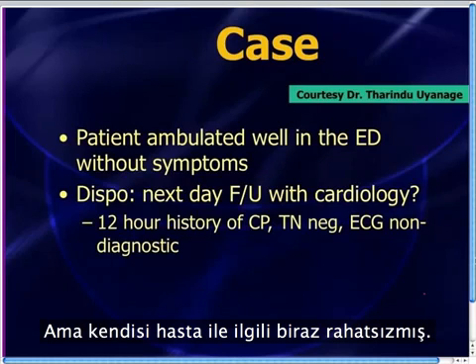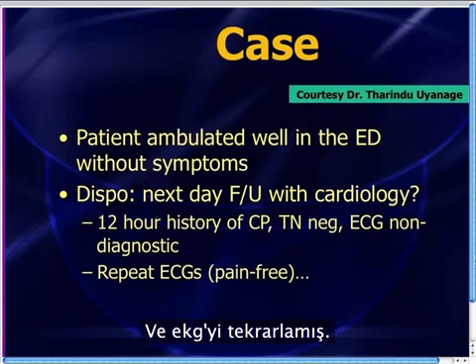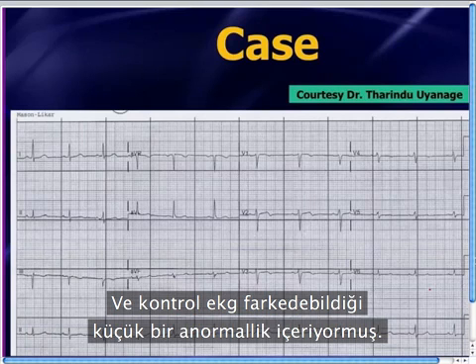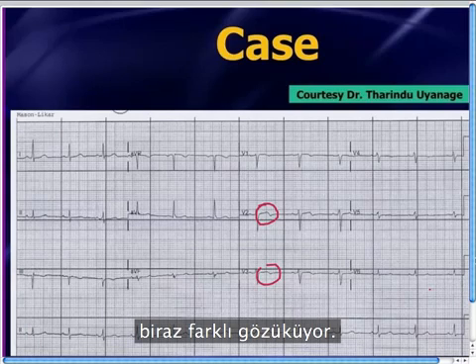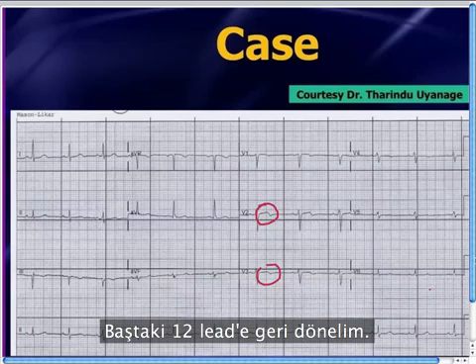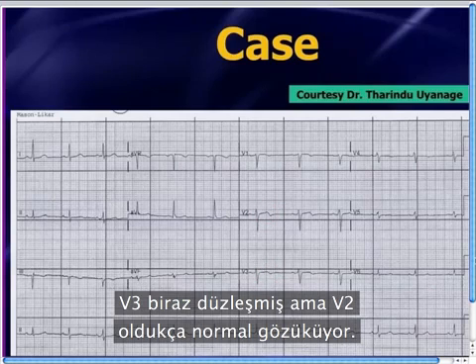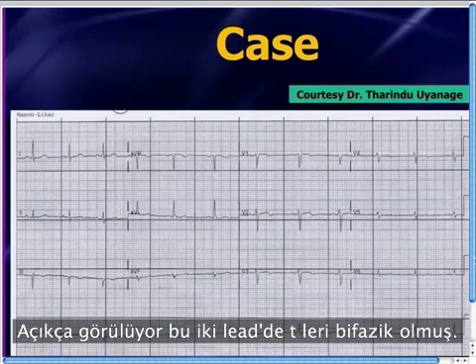Dr. Uyanagi was a little uncomfortable about this — maybe had a hunch that something more needed to be done. So he got a repeat EKG. Again, the patient was still pain-free. And the repeat EKG showed a slight abnormality he was able to pick up on: the T-waves in V2 and V3 were looking just a little bit different. Looking back at the original 12-lead, V3 was kind of flat but V2 looked pretty normal. Advancing to the later EKG, it had clearly become a bit biphasic in both of those leads.